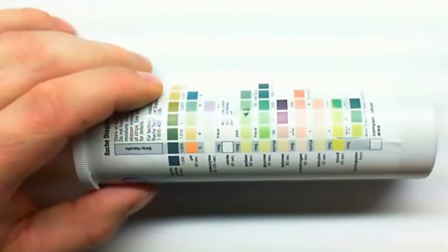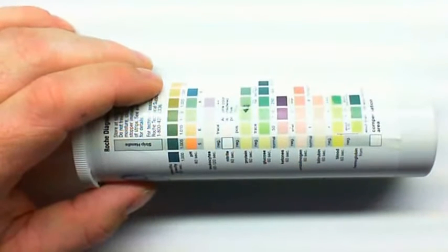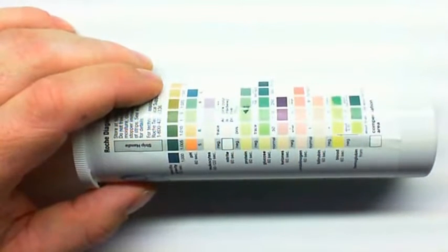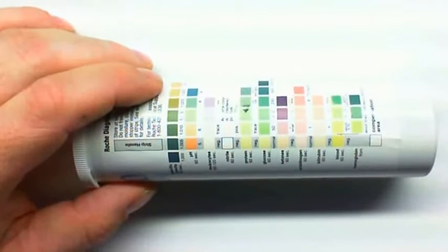And at least our lab manual only covers each individual test and describes those, and doesn't come back to the comparison of tests. So I will go through each test individually, but I also want to come back at the end and show you some demonstration urine sticks that I've kind of doctored up in order to show you how the comparison of the tests can hint at certain disease states.